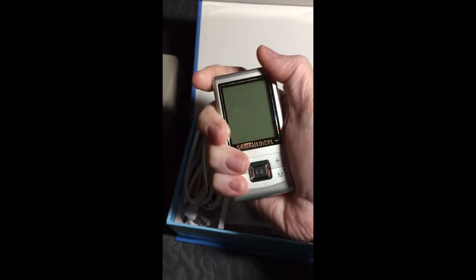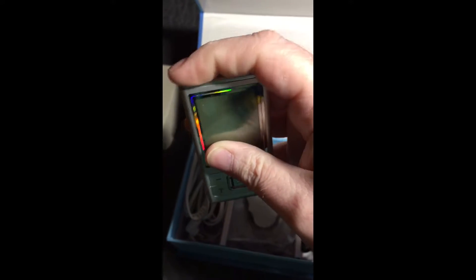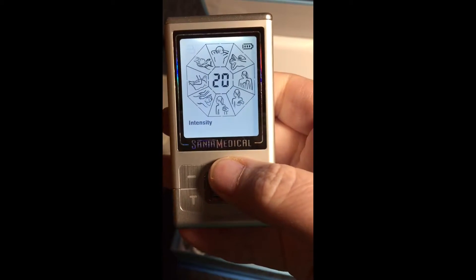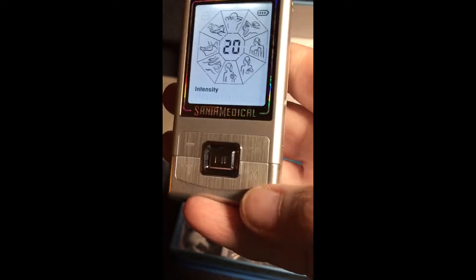As you can see, let me pop it out here — it's literally just a small handheld unit, really not very big at all. You power it on up here, you have your ports for the pads, and your controls here. Powered on, you have your different settings, your intensity levels, and all of that.